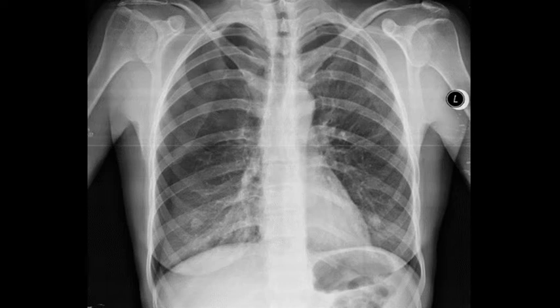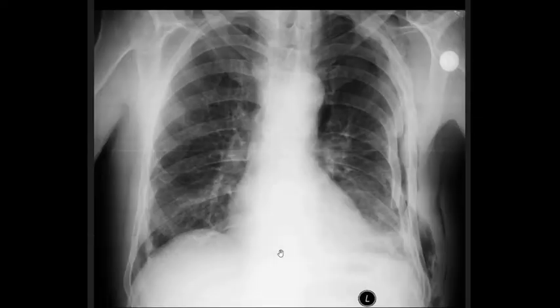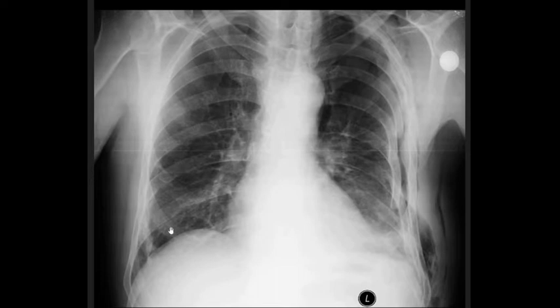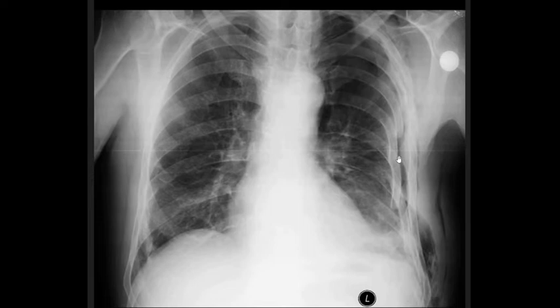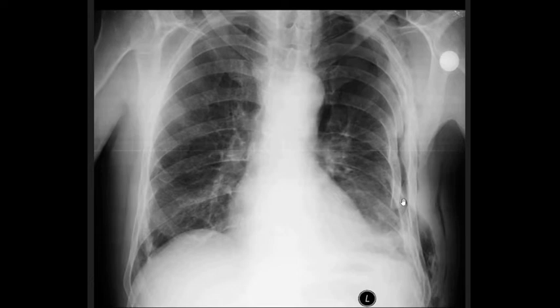Pneumothorax can be very subtle. In this next image, one lung field looks normal, but there is asymmetry. Comparing to the healthy side, we can identify broken ribs from the second to the sixth or seventh rib. In the dark space where we would expect lung vasculature, there is none — indicating a small partial pneumothorax.